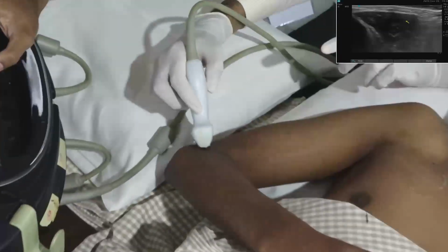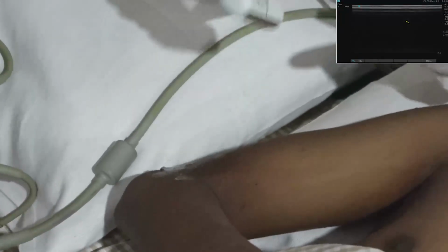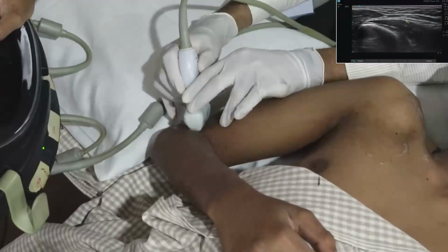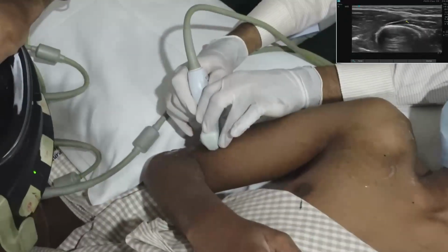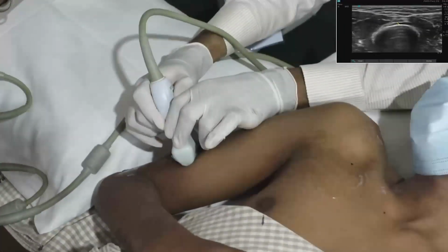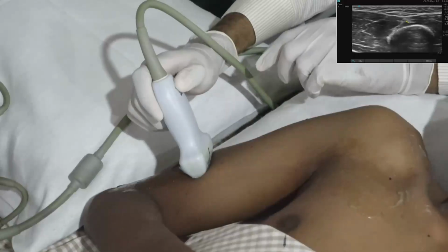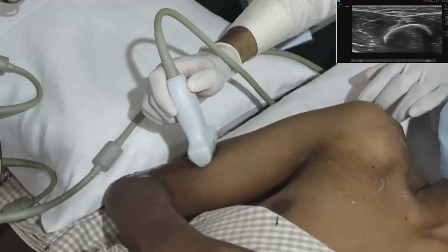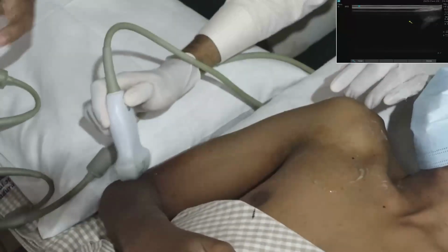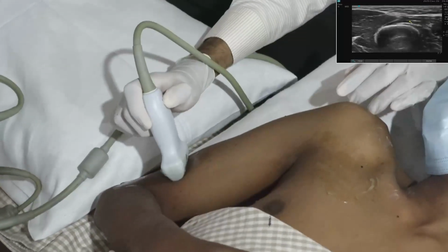I am keeping the probe over the lateral epicondyle. Here we see some neural component next to the humerus, which is even dividing. So this is where the proximal radial nerve is getting divided into two components.